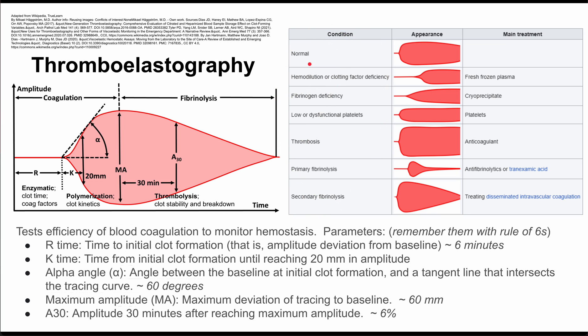A normal thromboelastography curve looks like this, also depicted here with some variation. This rule of sixes can help you remember the normal values for your parameters.